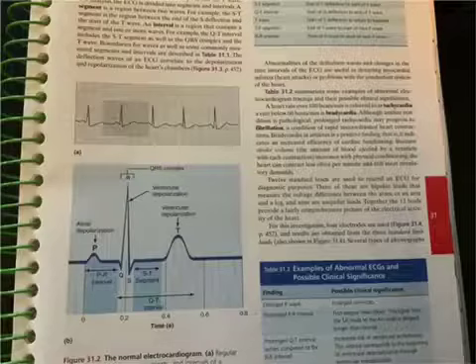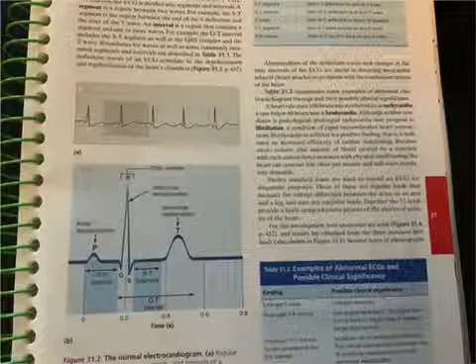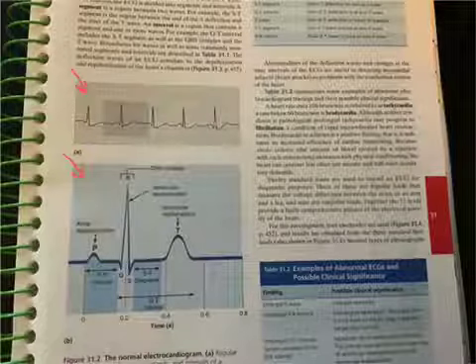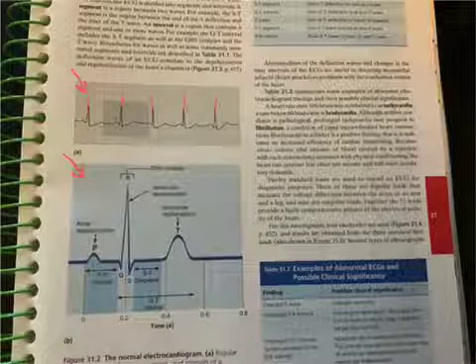As we turn the page in your book on page 451, you'll see probably a much better illustration of an electrocardiogram, obviously right here and right here. When you analyze an EKG, things to pay attention to are, do we have even spacing of these waves? And are the peaks relative to where they should be? The P wave by far should be the smallest peak because this is just looking at atrial tissue.